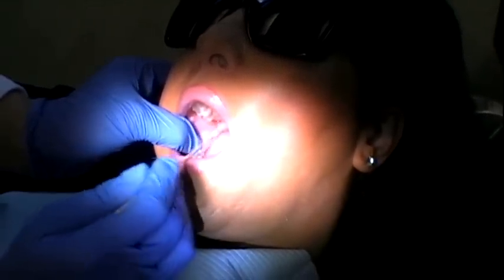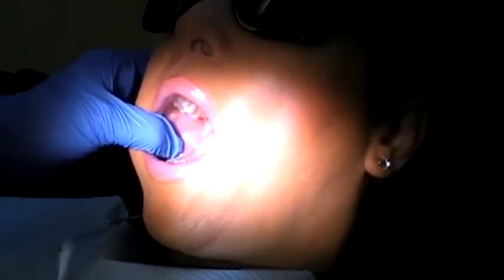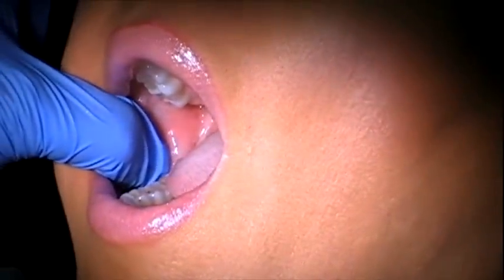I've already put the topical on and prepared the site. The Gow-Gates gets all the structures that the IA injection gets, but it also gets the auriculotemporal nerve, the mylohyoid nerve, and 75% of the time it gets the buccal nerve. It also gets the lingual nerve, the incisive nerve, and the mental nerve. It's a true block.